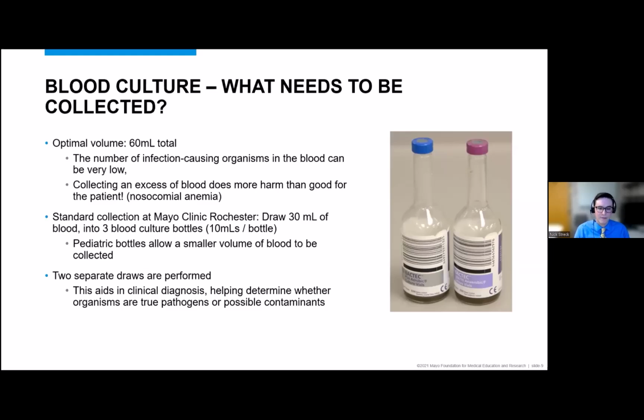So if you have an adult patient, we really want to get that full amount. Drawing a smaller amount and putting it into a pediatric bottle really isn't going to provide the best sample type and specimen volume for us to be able to identify microorganisms in the laboratory.